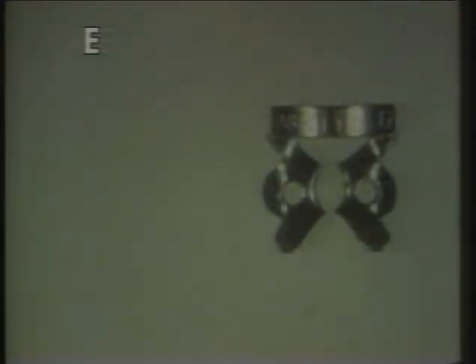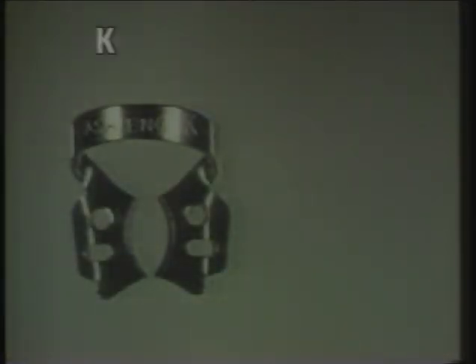The remaining specialized use of clamps is where single tooth isolation is considered adequate. Winged clamps are designed for this situation as they allow the dam to be carried to the tooth on the clamp. The E clamp is for very small teeth, the G is a retentive form for average diameter teeth, and the K is for large molars.